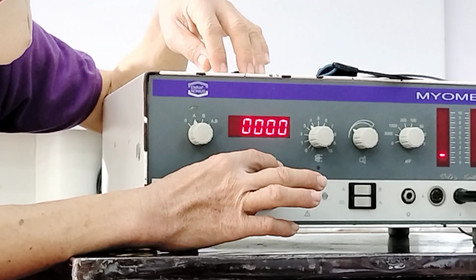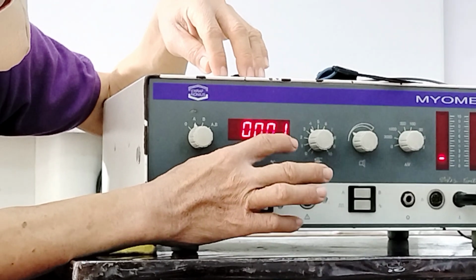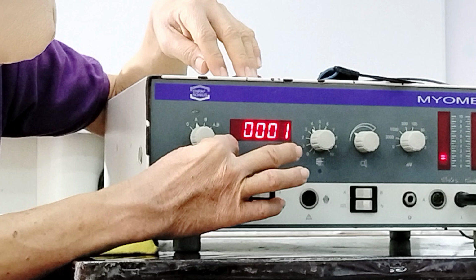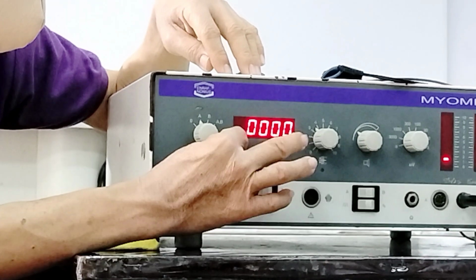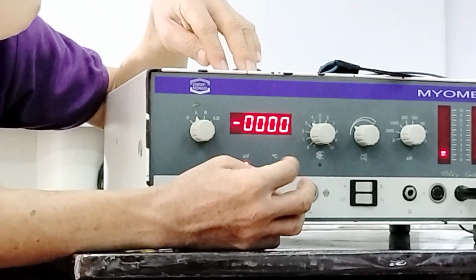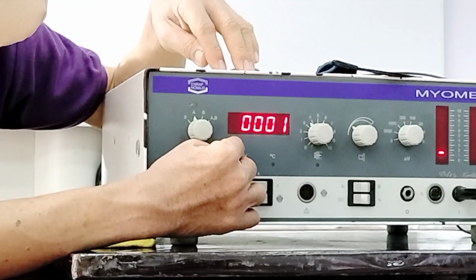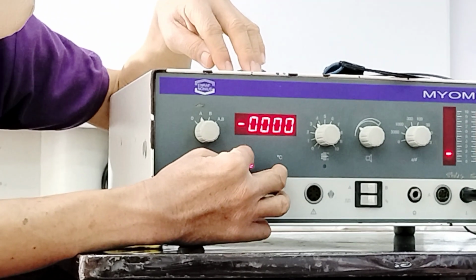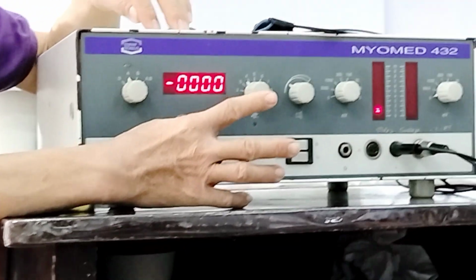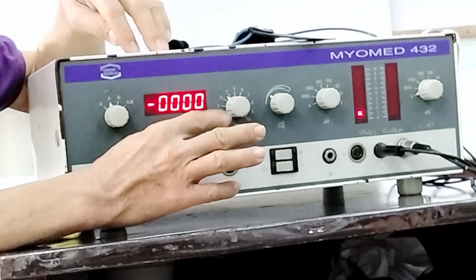So if 1 appears with degrees Celsius lit, it means 1 degree Celsius. But if microvolts is lit and 1 appears, we have 1 microvolt. Okay. So we usually focus on the microvolts part. We don't really use the temperature, just keep it in mind.